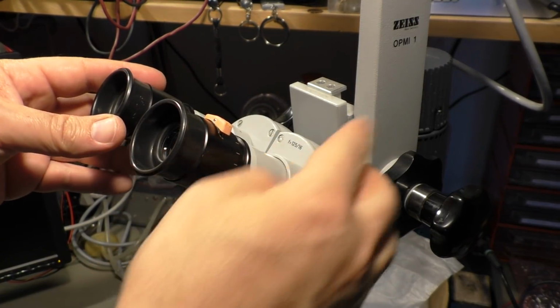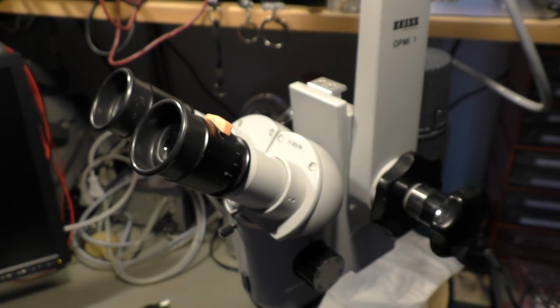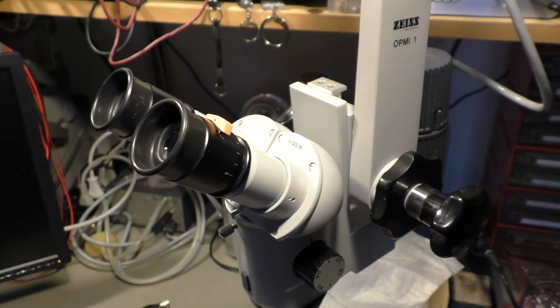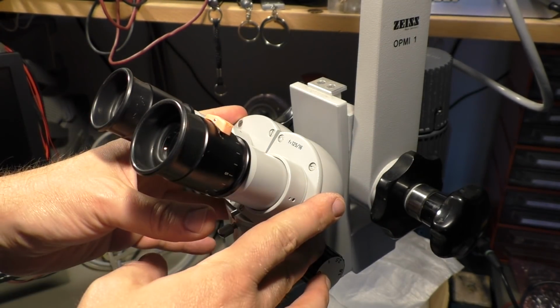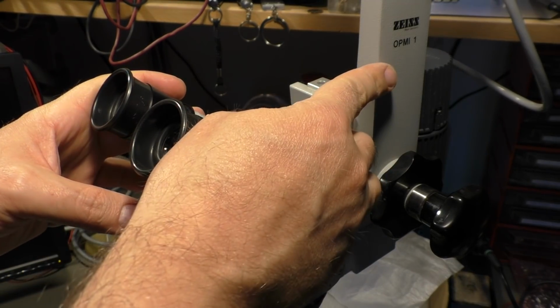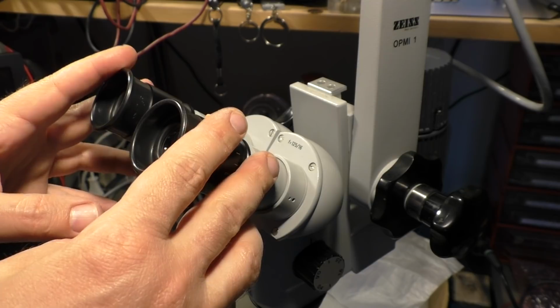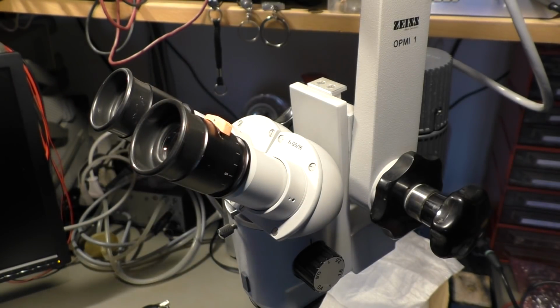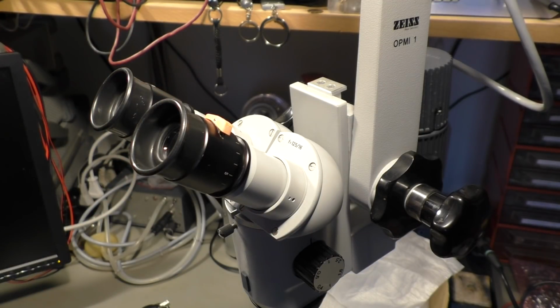And that's my Zeiss OPMI-1 operation or surgery microscope, which I bought for not so much money. And if you find one of these, I would highly recommend to buy it, because it's a super microscope. It was once about $10,000 when it was new. You can get it for a couple of hundred today.